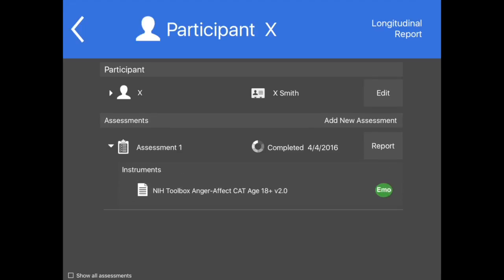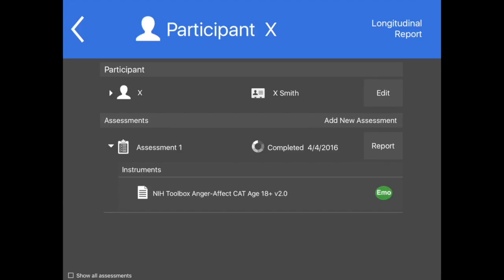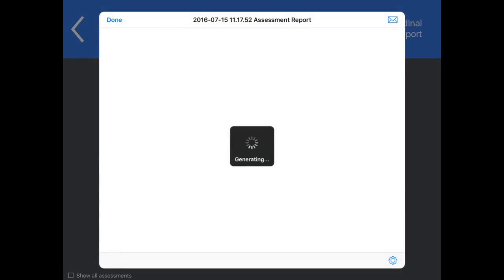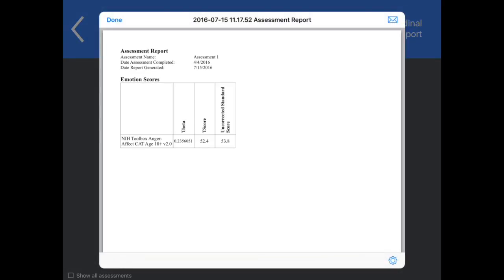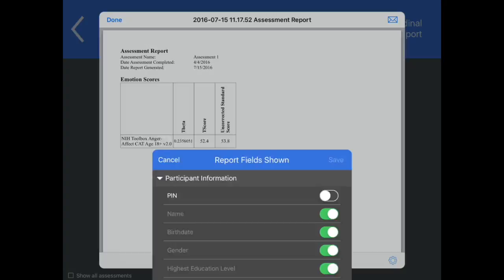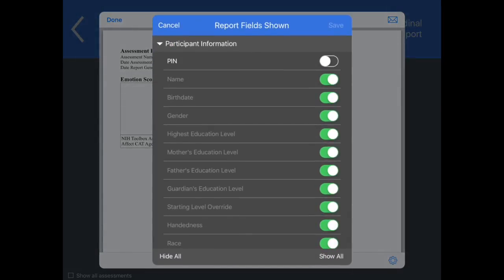Once an assessment is completed, a simple report can be generated by tapping Report. Reports contain demographic information and scores for any tests that were given during that specific assessment. This information can be modified according to your preferences.